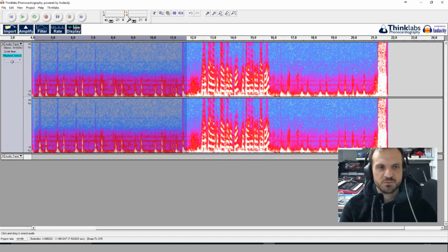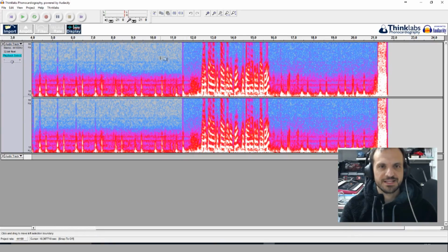And you can see the spectrum's changed now, so it's removed a certain amount of information. See, the top half is lighter. That means there's less noise in it, basically. So let's have a listen. That was me talking. And then, of course, there's the bit where my stomach gargled at the end. Let's have a little listen to that, too.